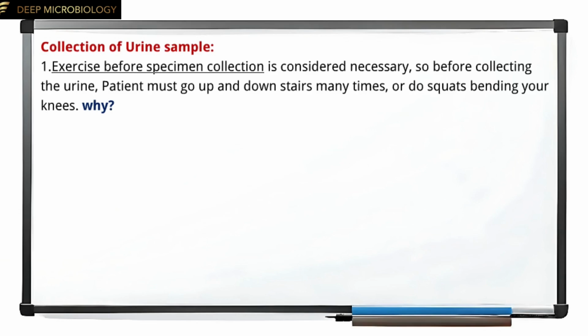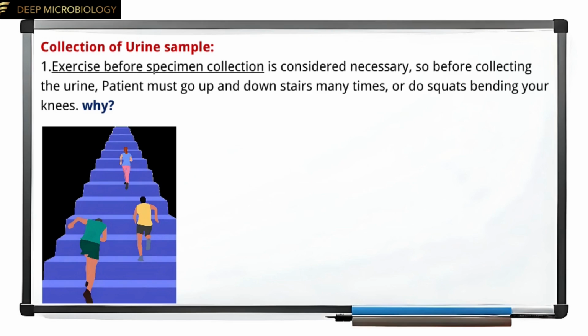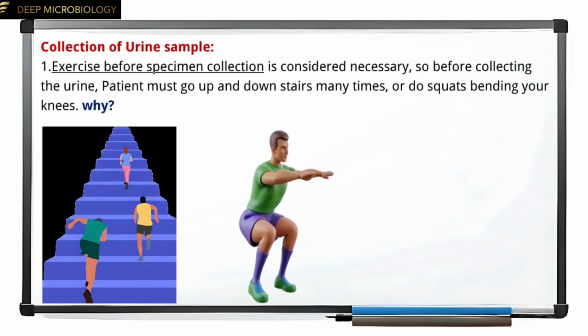Collection of urine sample. 1. Exercise before specimen collection is considered necessary, so before collecting urine, the patient must go up and down stairs many times, or do squats, bending the knees.